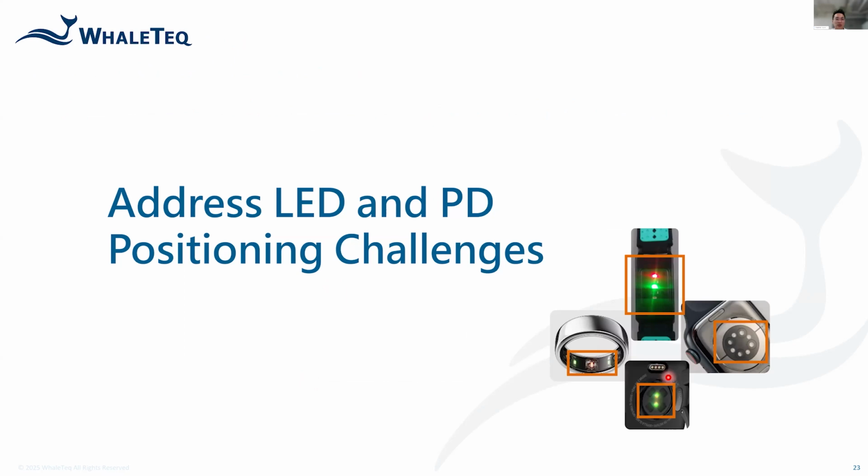You can see so many very fashionable wearable devices, and they became a cornerstone in monitoring. And these devices transformed from the simple heart rate monitor to a sophisticated health tracker capable of providing insight into cardiovascular health, oxygen concentration, even the stress level. However, the effectiveness of the PPG sensor is heavily influenced by the positioning of the LED and the PDs.